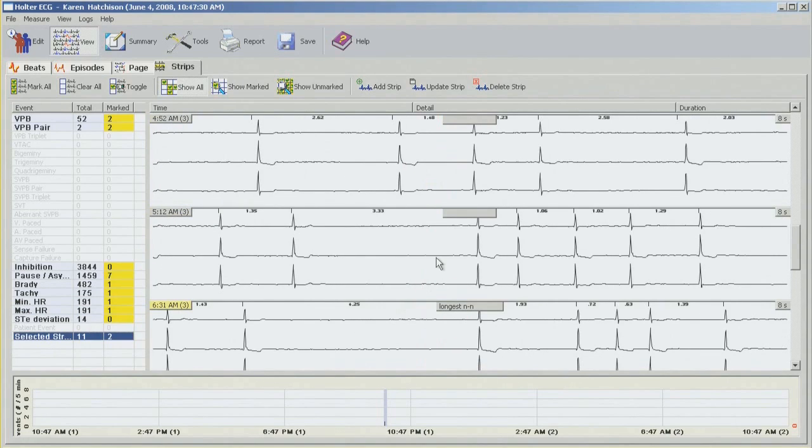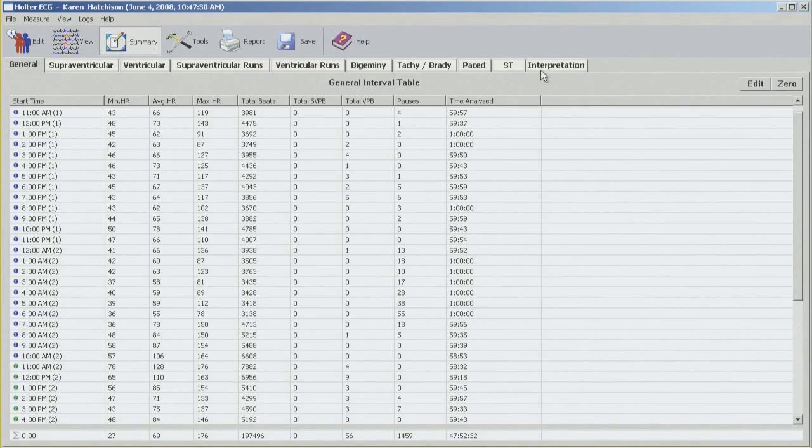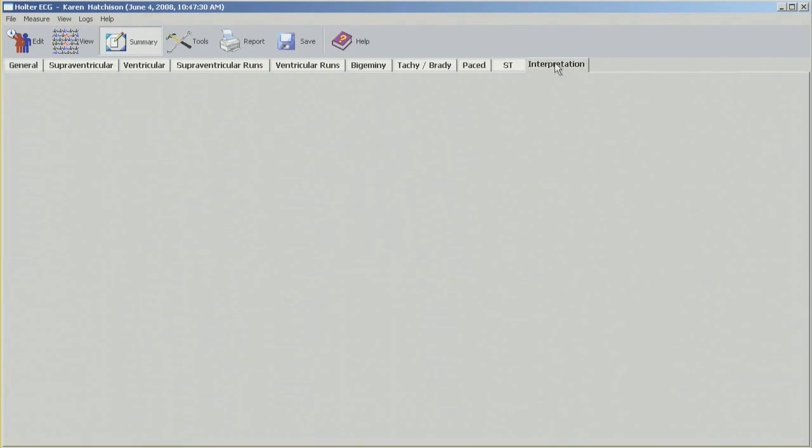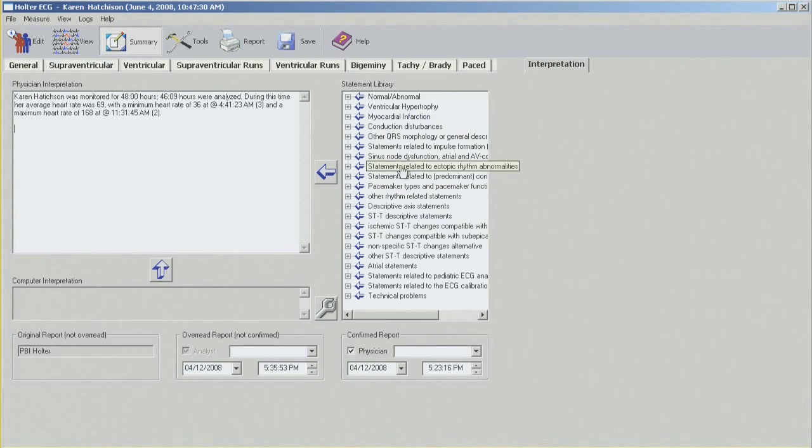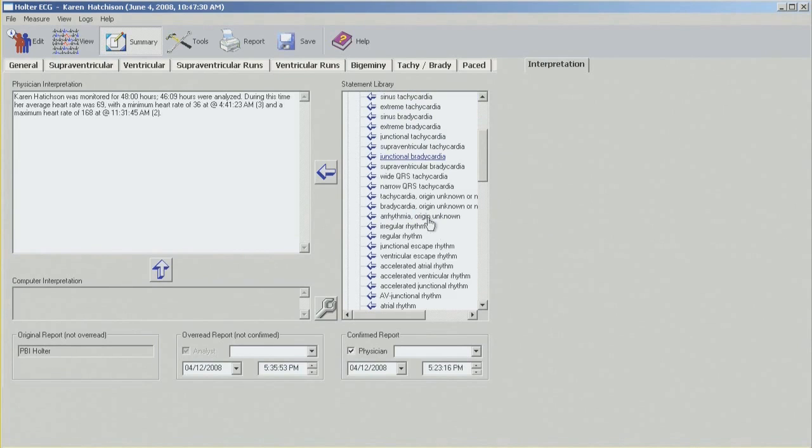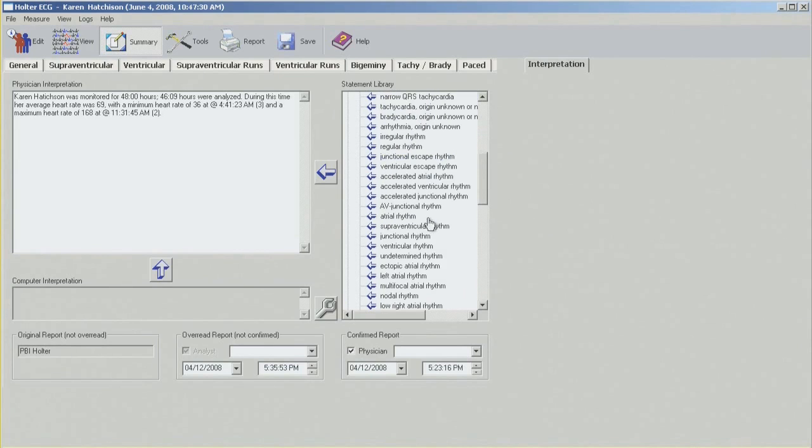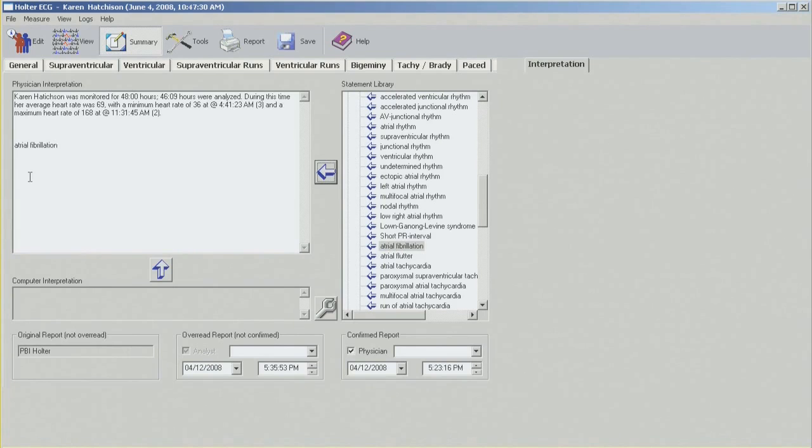And the last thing to do is go into summary and interpretation. And this is the field where you can type your own interpretation, or you can use any of the statements from the pull down menu on the right hand side. So let's say you want to label this atrial fibrillation. You should be able to find it here. Click on it. So at this point, once you finish with interpretation, the last thing to do is to save the report.